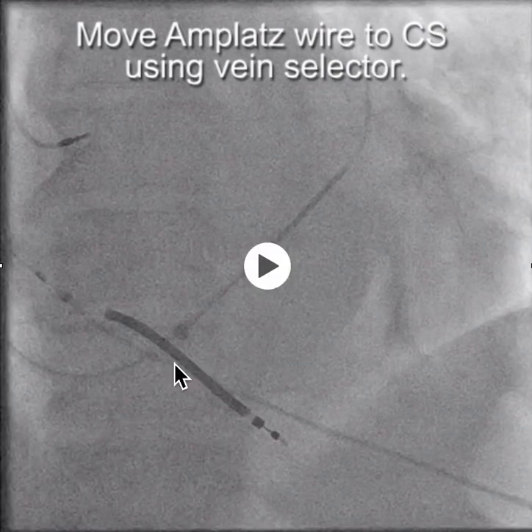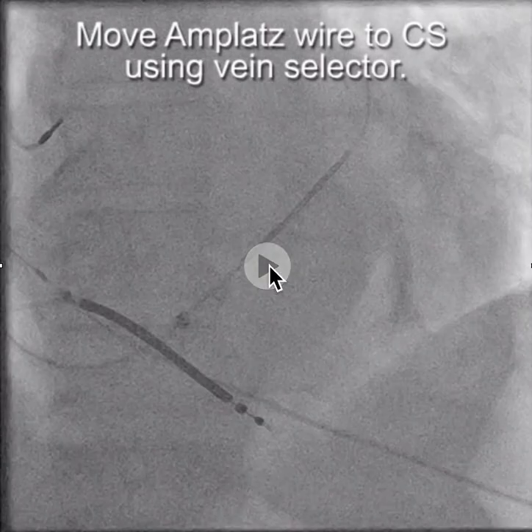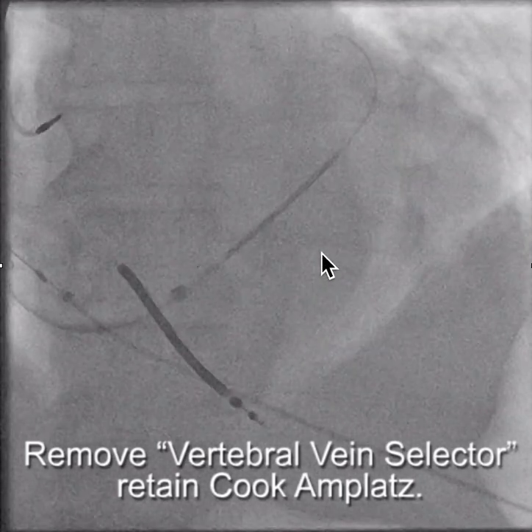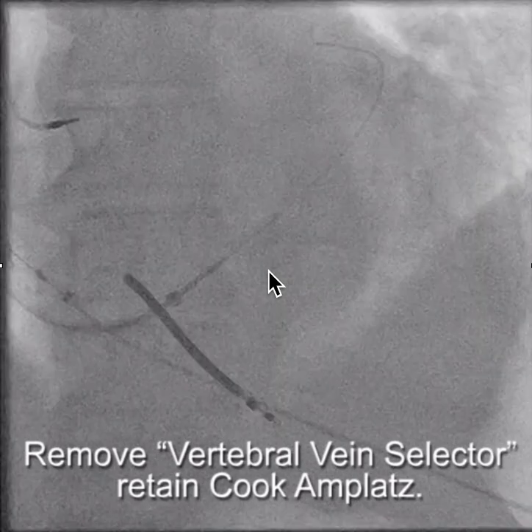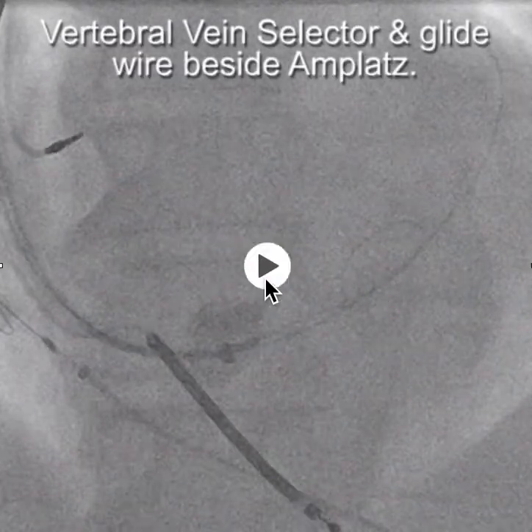We then wanted to get our Amplatz wire into the true CS rather than the middle cardiac vein. So we took the Amplatz wire out of the middle cardiac vein and then put it into the vein selector, which was in the CS. Now we have the Amplatz wire in the CS and we're taking the vein selector out, so now we're relying on the Amplatz wire to stabilize the sheath.